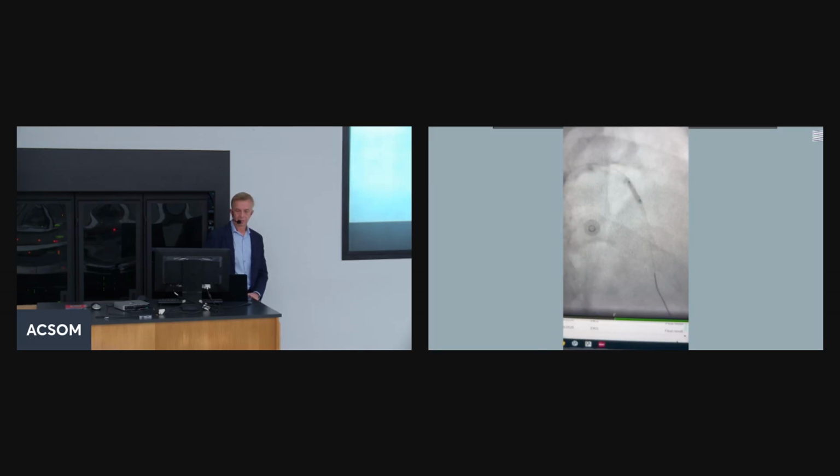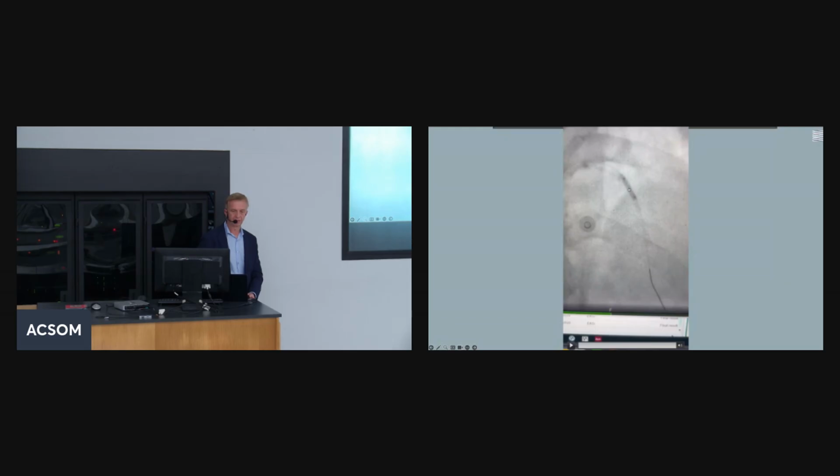So this patient underwent angioplasty. Again, we put a little larger catheter, and on the catheter there is a balloon that we inflate at the site where the stenosis is, and then we deploy the stent, which is like a little metal tube that keeps the blockage open. So it's the angioplasty and stenting. This is the balloon that is inflated in the area of the stenosis.